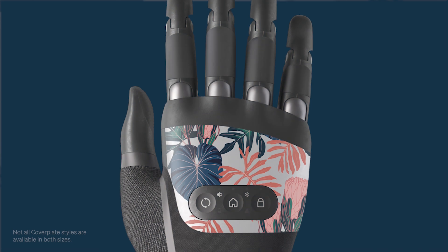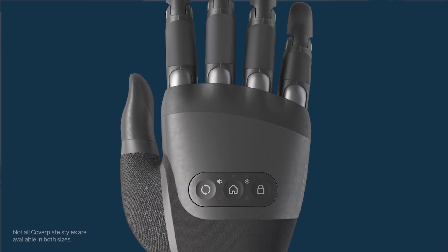Besides other minor dimensional differences, both small and medium Tasker CX hands have the same digit speed, grip forces, and can carry up to 20kg. Also, they both can be personalised with a range of colour plates.